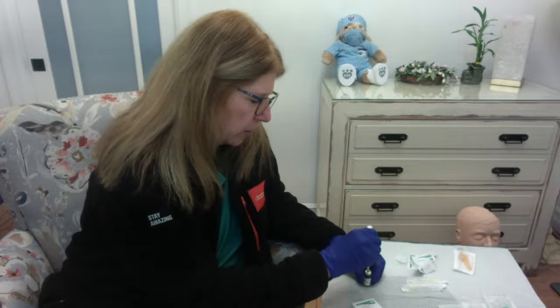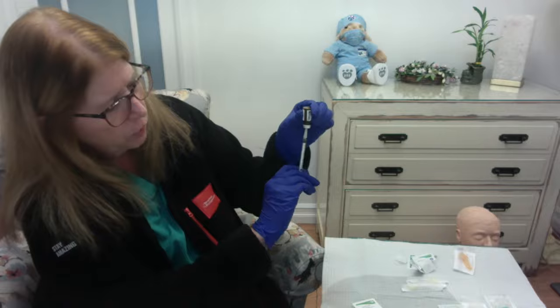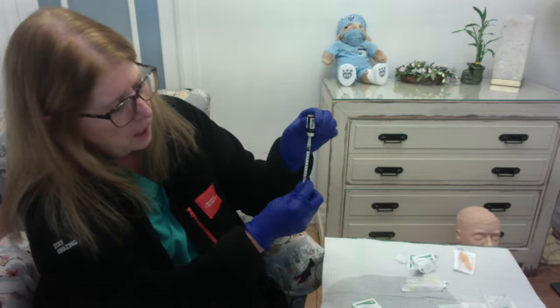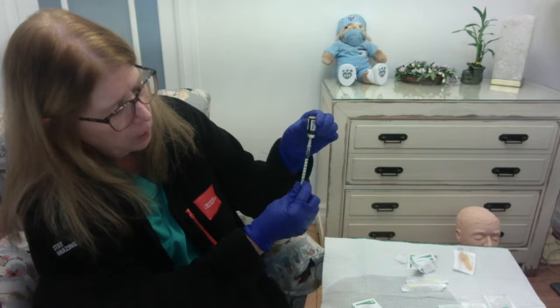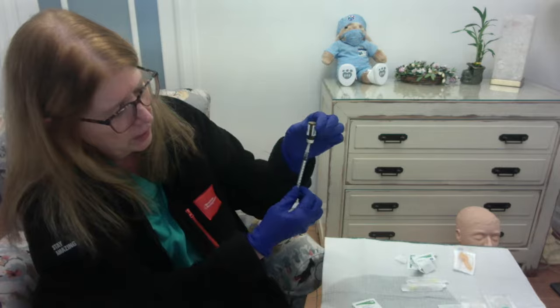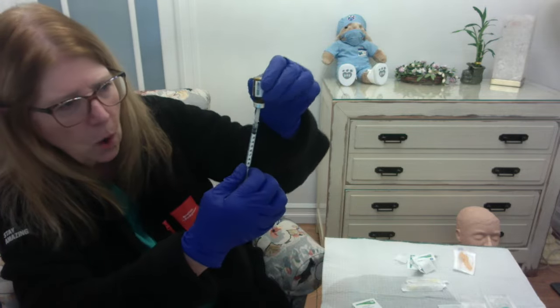I'm going to go right into the center. I'm going to inject my air. I'm going to flip it up so the window is facing me, have the calibrations facing me, and I'm going to pull back that 0.1 milliliter. Go a little further than I needed, and so I push everything back up until I get to that 0.1.